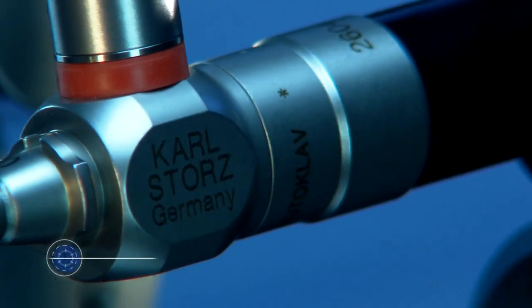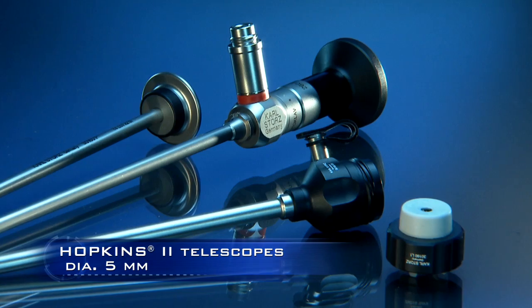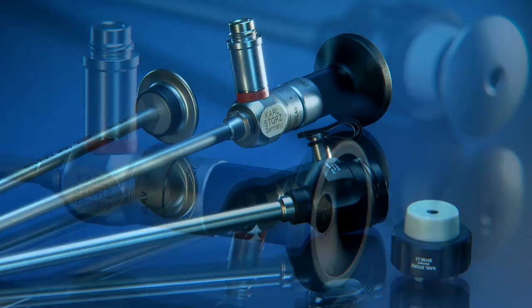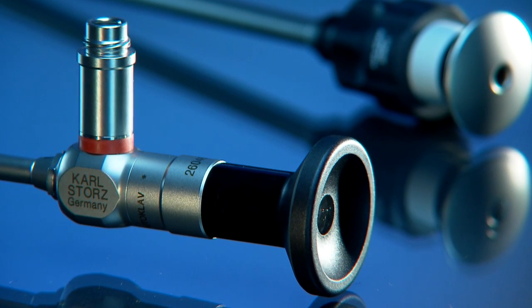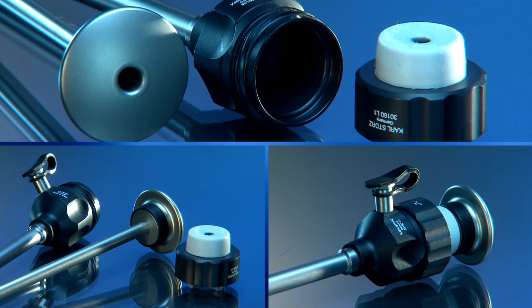The Hopkins II telescope with a diameter of 5mm is being used ever more widely in laparoscopy as it offers excellent image quality and at the same time only requires a 6mm trocar, which reduces access trauma.